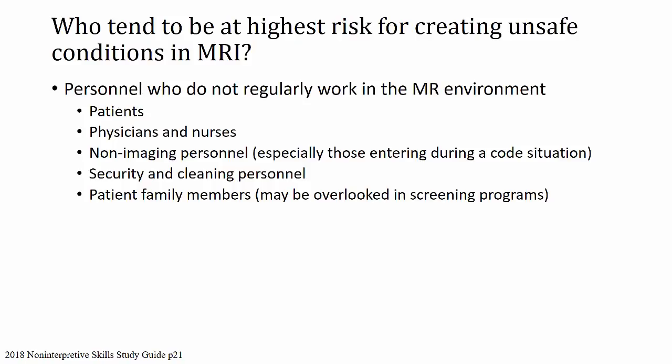And these often may be overlooked in the screening programs because you're so focused on the patient, you may forget about the family members. So those are the people at highest risk, those who are typically not in the MR environment, so you need to watch them carefully.